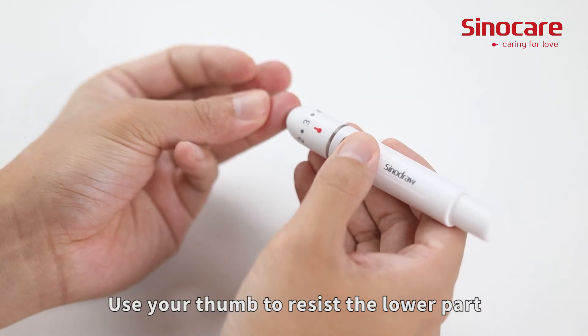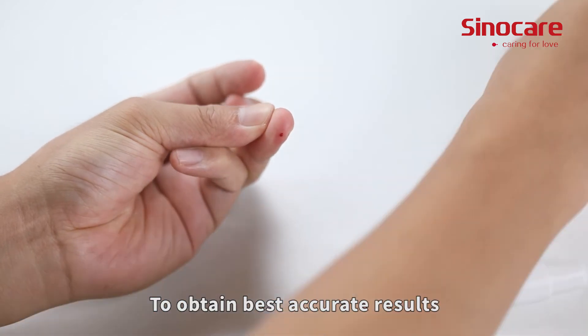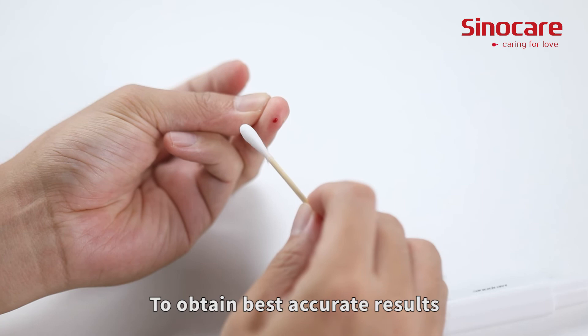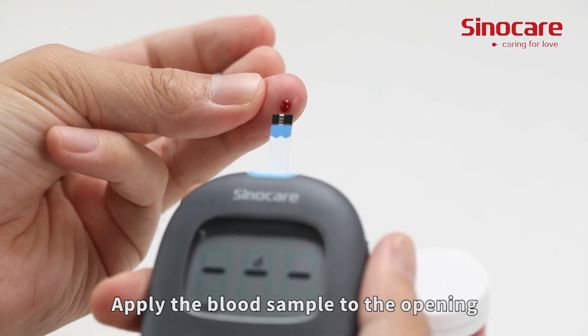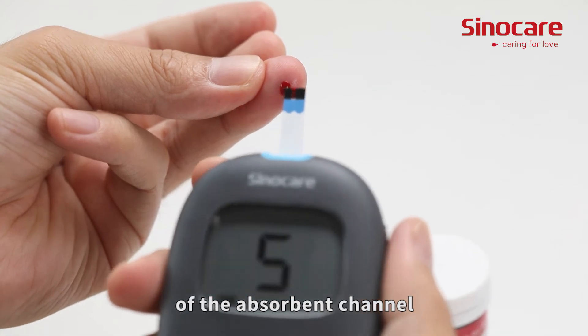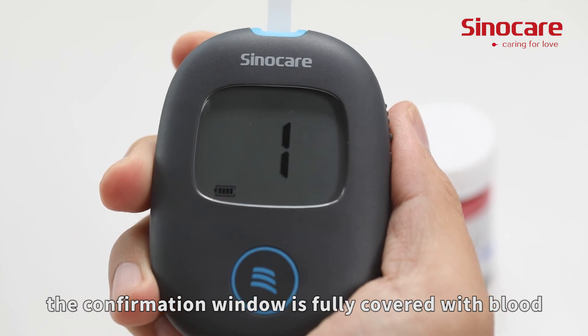Use your thumb to press the lower part of the puncture device to help the blood draw. To obtain the best accurate results, wipe off the first drop of blood and squeeze another. Apply the blood sample to the opening of the absorbent channel of the test strip until the confirmation window is fully covered with blood.